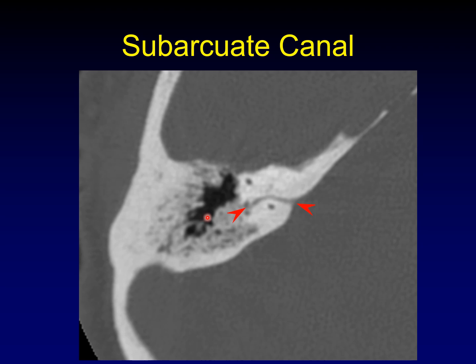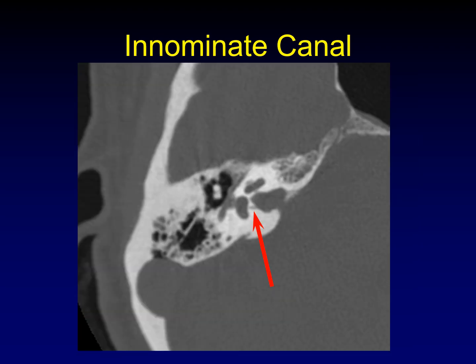In Europe, this is called the petromastoid canal — that's a synonym for the subarcuate canal. This very straight, very fractured-looking object is called the innominate canal. It carries the singular nerve between the internal auditory canal and the vestibule. This may also be called the singular canal because it carries the singular nerve, and frankly, innominate canal is a lousy name.